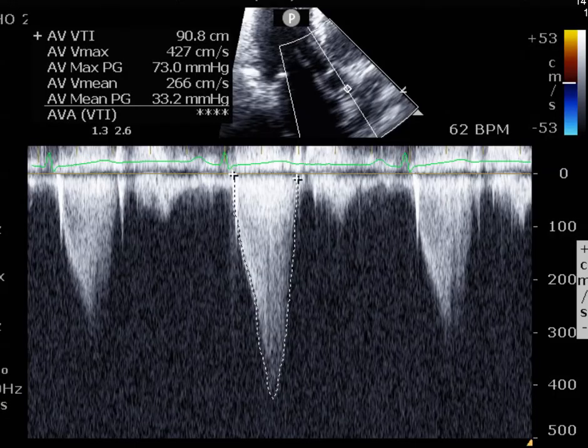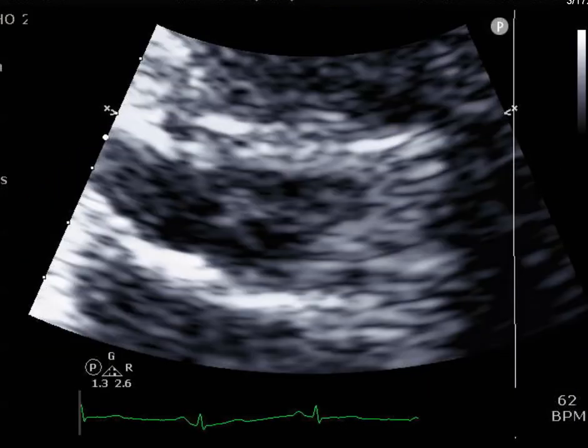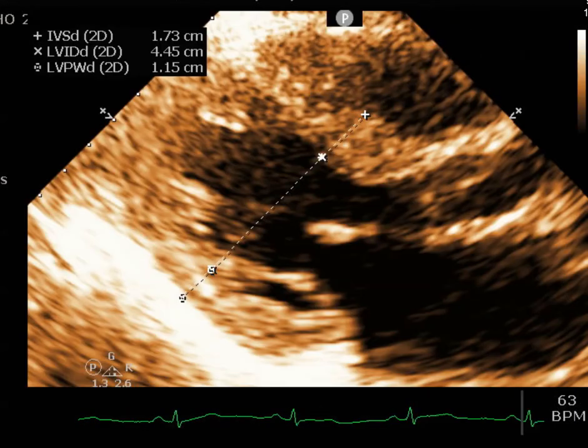Okay, so I hope that was helpful. And so just in summary, this is a person with hypertrophic cardiomyopathy. Septum is measuring at about 1.7, so not really meeting ICD criteria by this alone, but I guess they would need some other testing to tell as well.